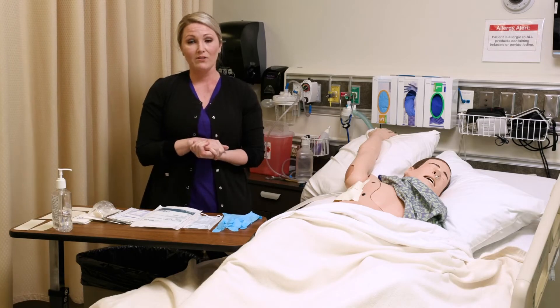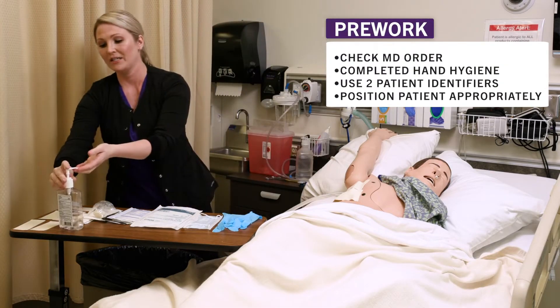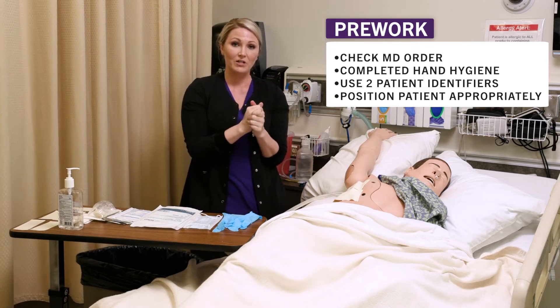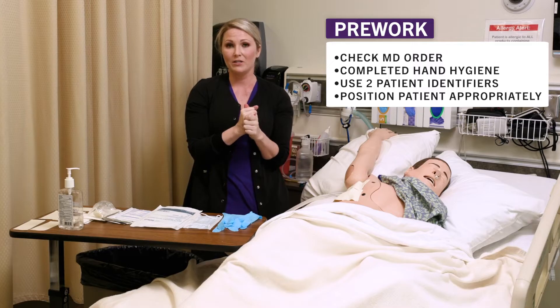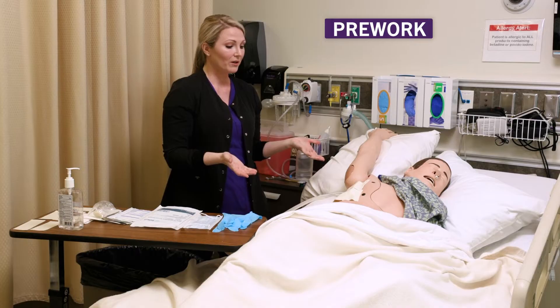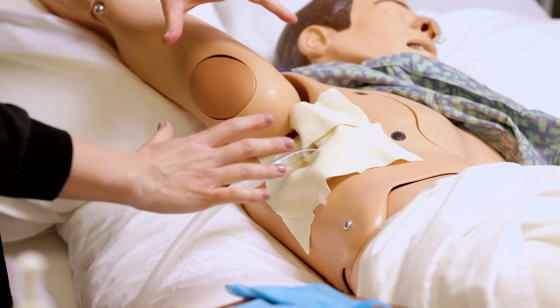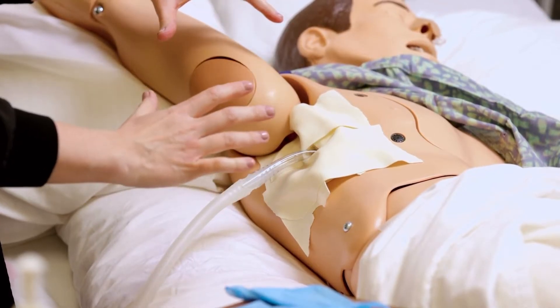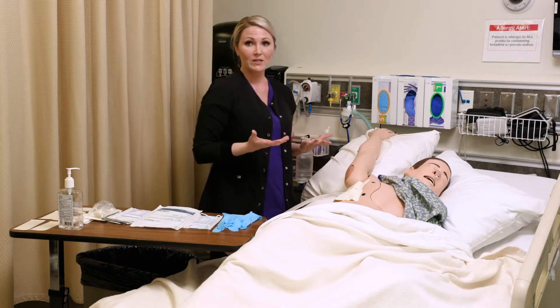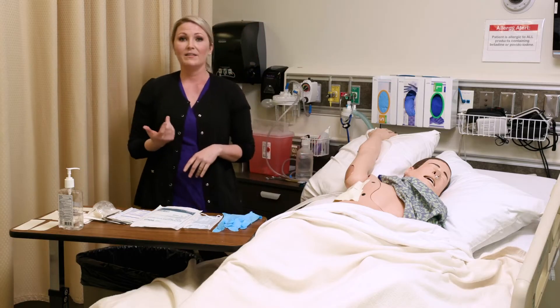Let's make sure I've done all of my pre-work. I've checked the MD order, I've completed my hand hygiene, I've used my two patient identifiers to make sure this is the correct patient and it matches the MD order. I've also got some assistance to position my patient appropriately so that the lateral side of the chest is open and I can gain access to that chest tube insertion site. I'm also going to make sure the bed is at an appropriate working height so I'm not bending or hunching over my patient, that they are safe, and that I've provided some privacy.